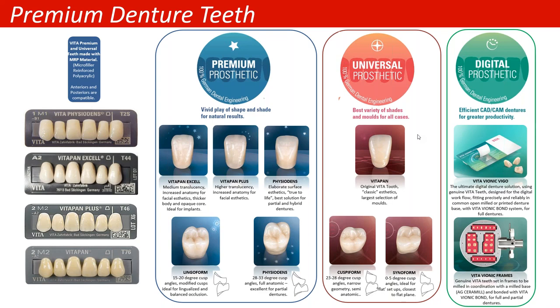I think I'm going to relate this basically to crown and bridge. For removables, we are so used to just getting a shade and then just getting a mold. But for me, there's a lot more to that. It's the indication, just like crown and bridge, where if you're milling, we pick and choose the materials on the basis of opacity and translucency, and then texture as well. And those things can also become critical, especially today with modern dentures, where we want to make the patient a little bit more youthful. And it's going to fall in different criteria.